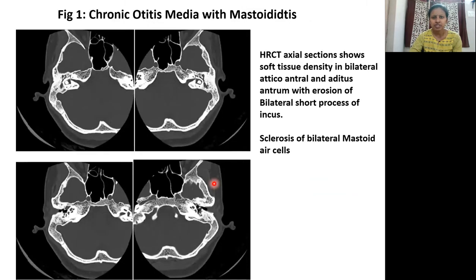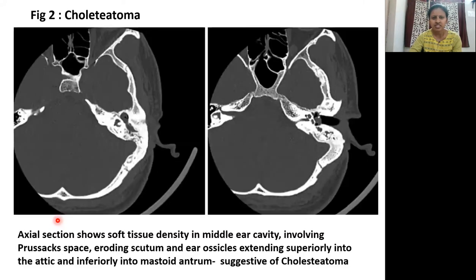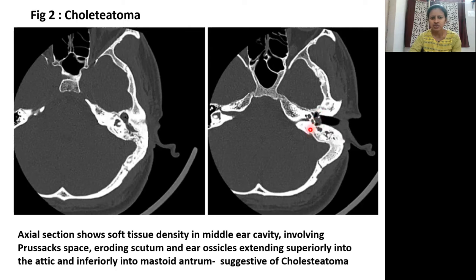This is a case of chronic otitis media with mastoid disease. HRCT axial section shows soft tissue density in the bilateral atticoantral and aditus with erosion of the bilateral short process of the incus. You can also see sclerosis of the bilateral mastoid. This is a case of cholesteatoma. In these sections, we see soft tissue density in the middle ear involving the Prussak's space, eroding the scutum and ossicles, extending superiorly into the attic and inferiorly into the mastoid antrum, suggestive of cholesteatoma.